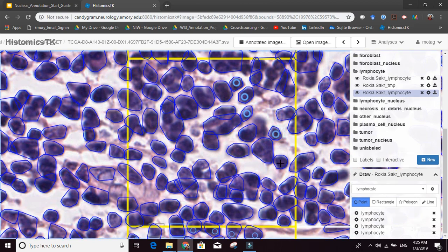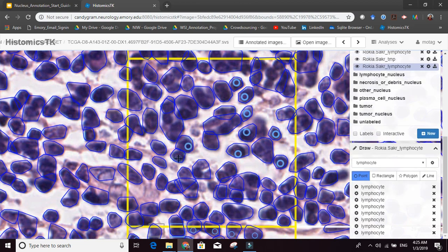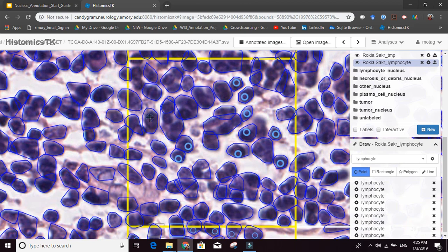So click here, click here, click here, right? Let's actually finish one field of view just to show you that it's actually pretty quick. You can really quickly finish one of these things. So I'm going to finish it in a couple of minutes while you're with me on this.